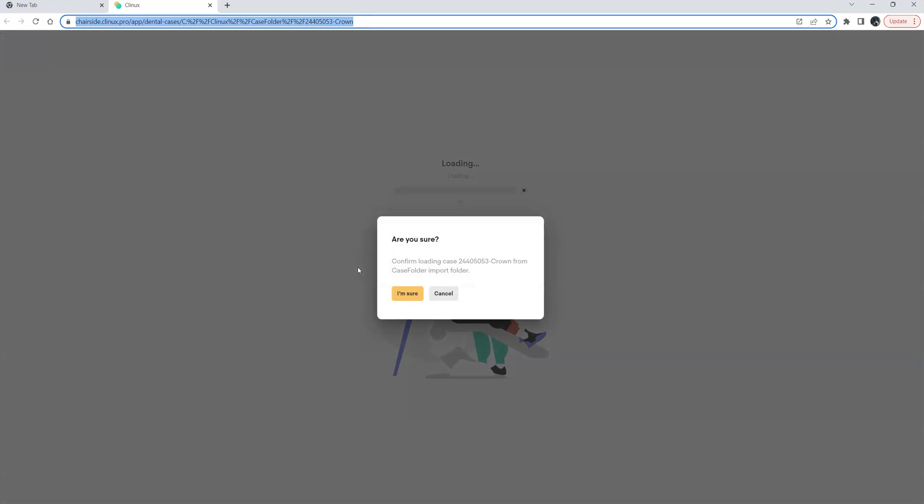Clinics is the only browser-based software of its kind. There's nothing you need to install, there's nothing you need to do. Updates are pushed automatically. So when we push that Clinics button inside of MeditLink it'll automatically open the browser.